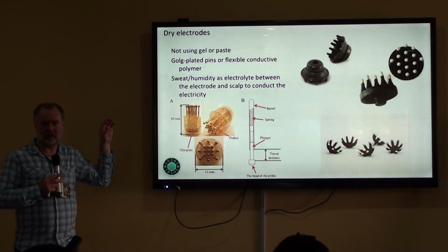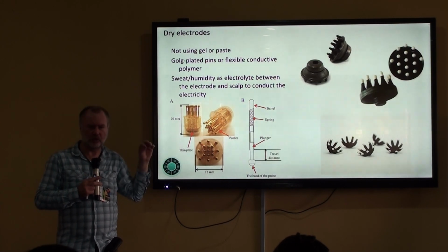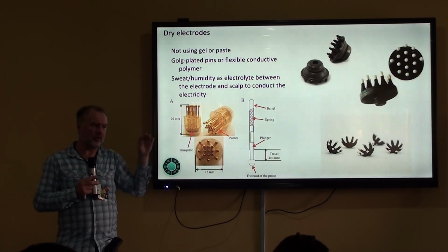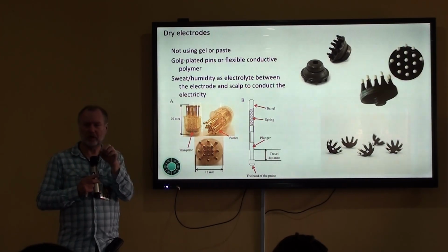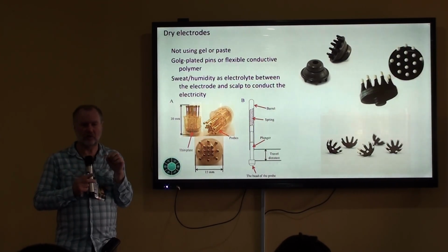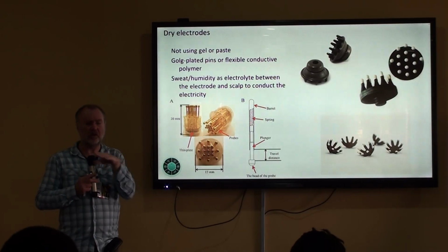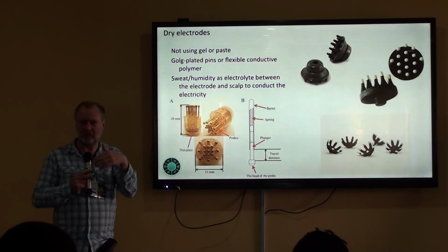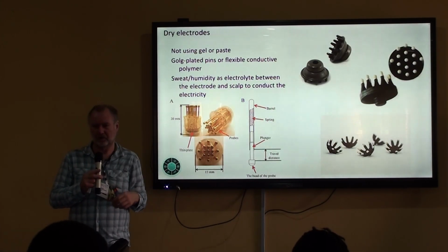But in general, I'm not very enthusiastic about using these for research, because for research we often care about very small voltages, and these very small voltages just require the best electrodes that we can use. So if possible, I would always use the best equipment and the best procedures in the lab, rather than doing something that is fast.